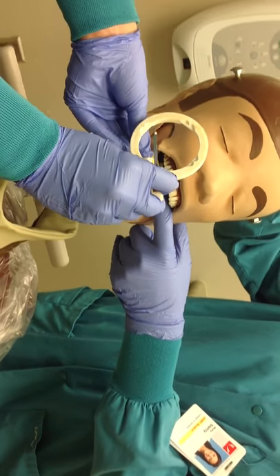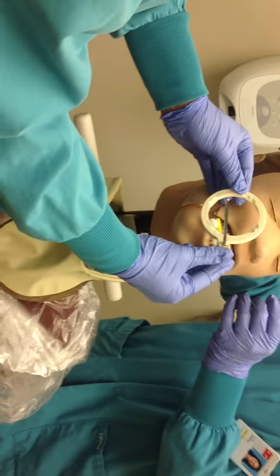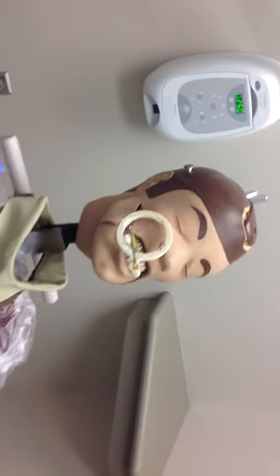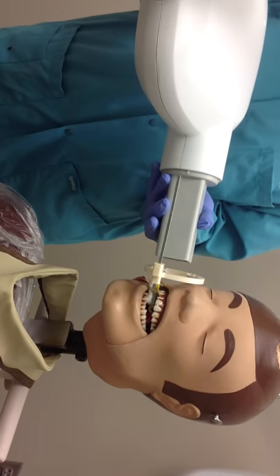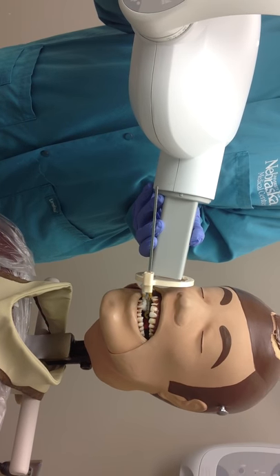Have the patient slowly close. Push the ring up to the patient to achieve a positive 10 to 20 degree vertical angle. Make sure the PID is in a horizontal orientation and line it up with the notches in the ring.